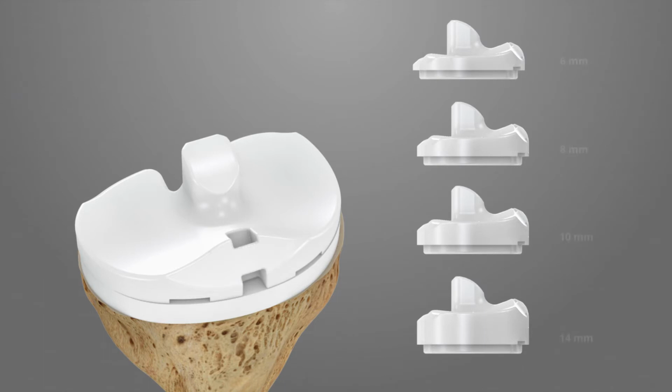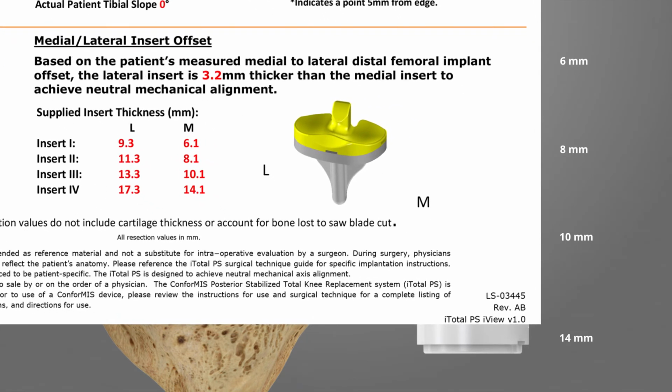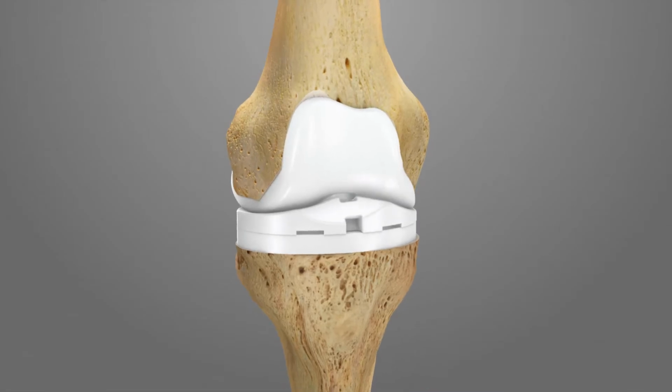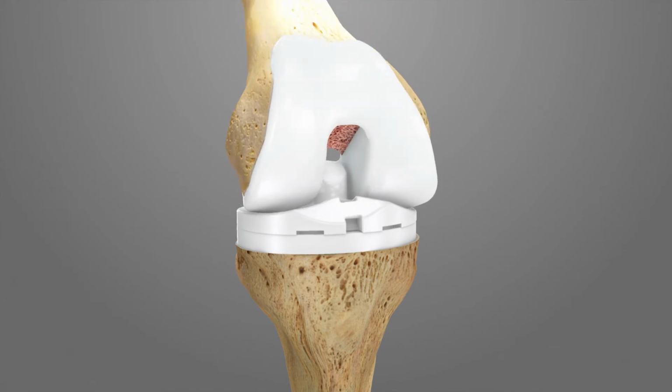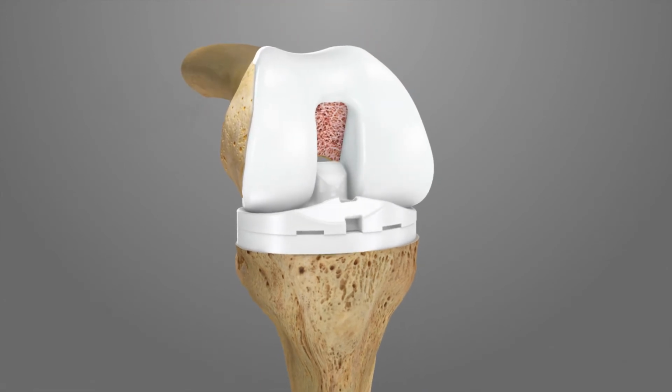The numerical value of the insert represents the thickness of the medial side of the insert. The lateral side of the poly measures the numerical value of the medial side in millimeters plus the distal femoral implant offset. Successive trial inserts increase in thickness while maintaining the distal femoral offset, which is provided on the iView patient-specific planning images. Bring the joint through the range of motion to evaluate kinematics and ligament balance. Use different trial insert thicknesses to achieve desired balance and alignment.